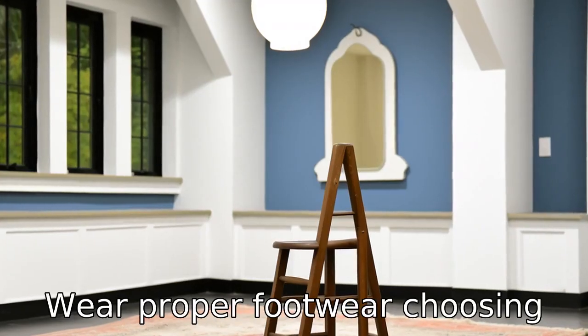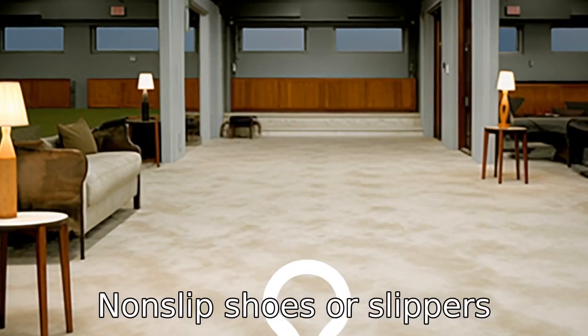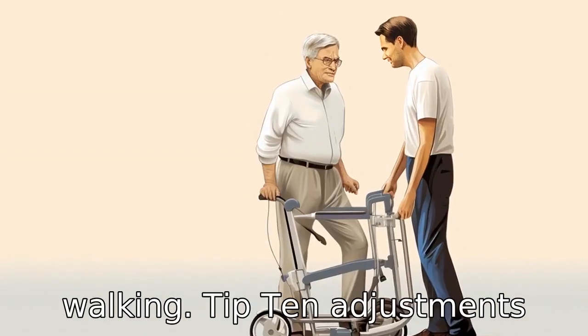Tip 9: Wear proper footwear. Choosing the right footwear can also help prevent slips and falls. Non-slip shoes or slippers provide additional grip while walking.